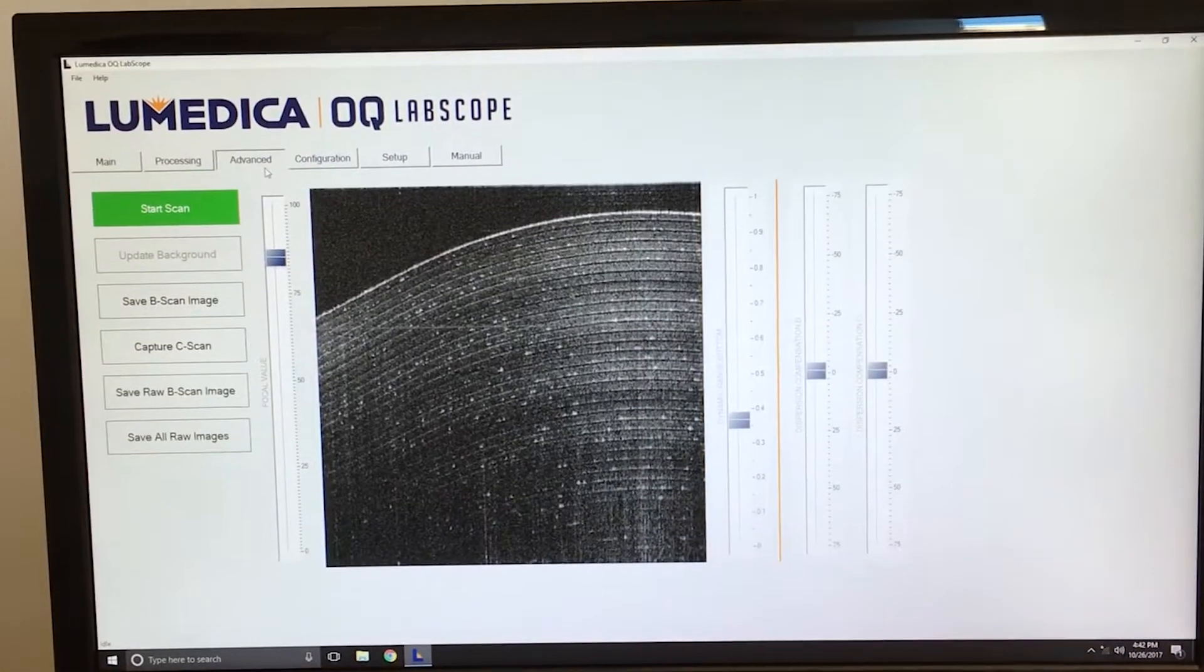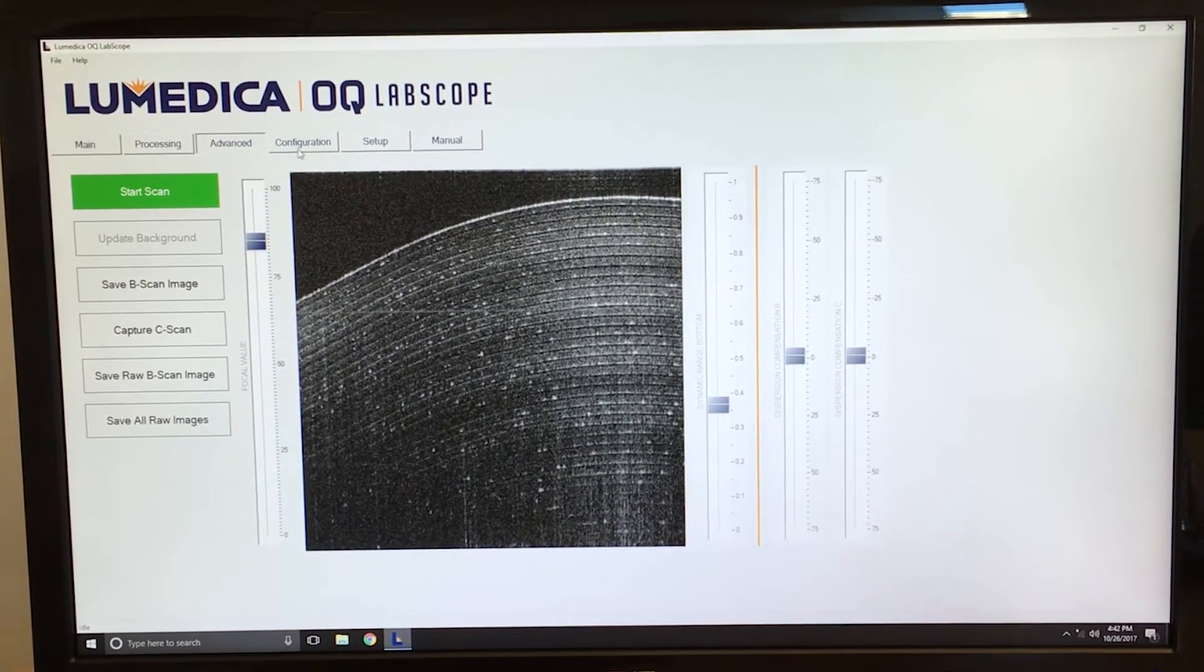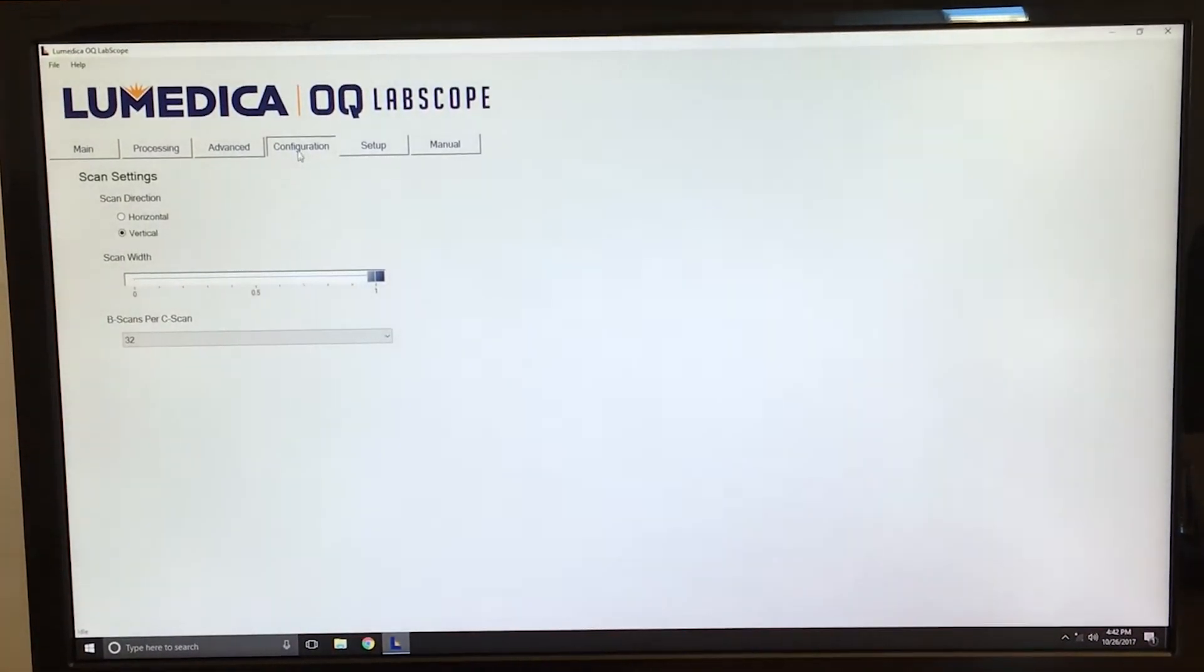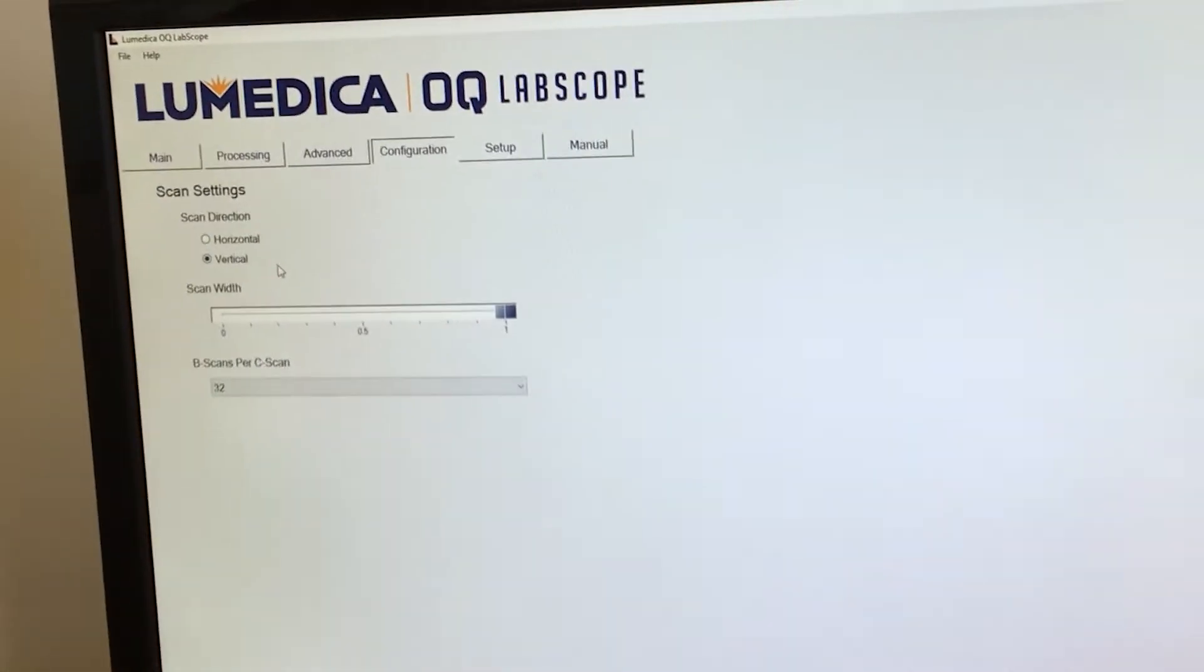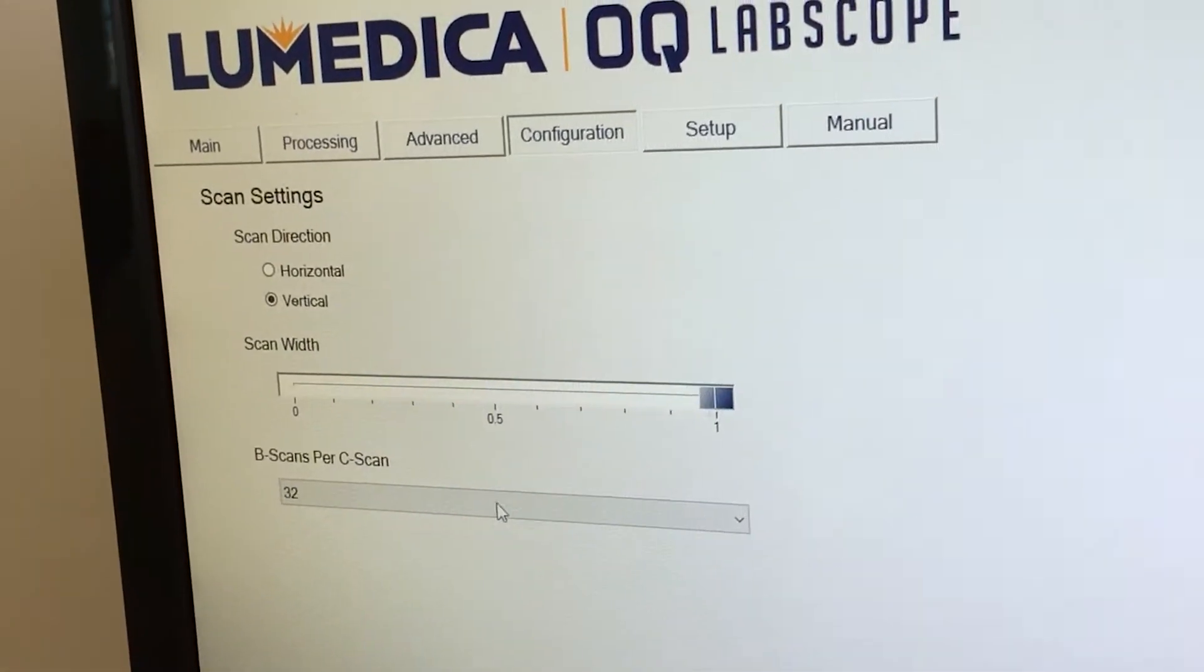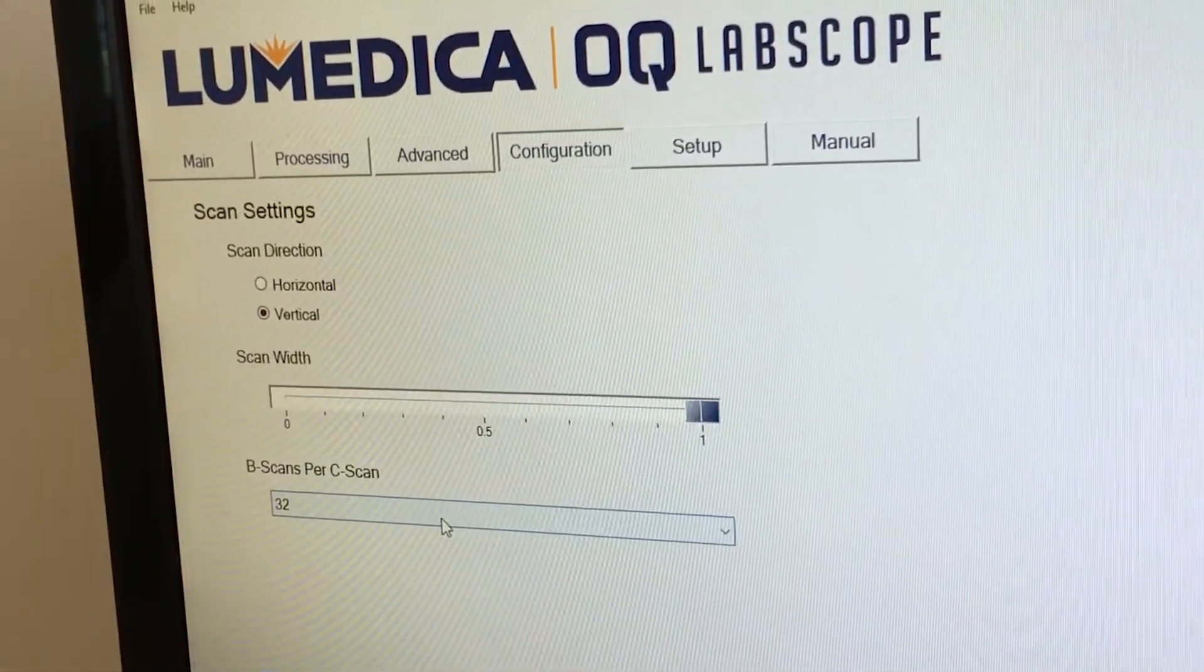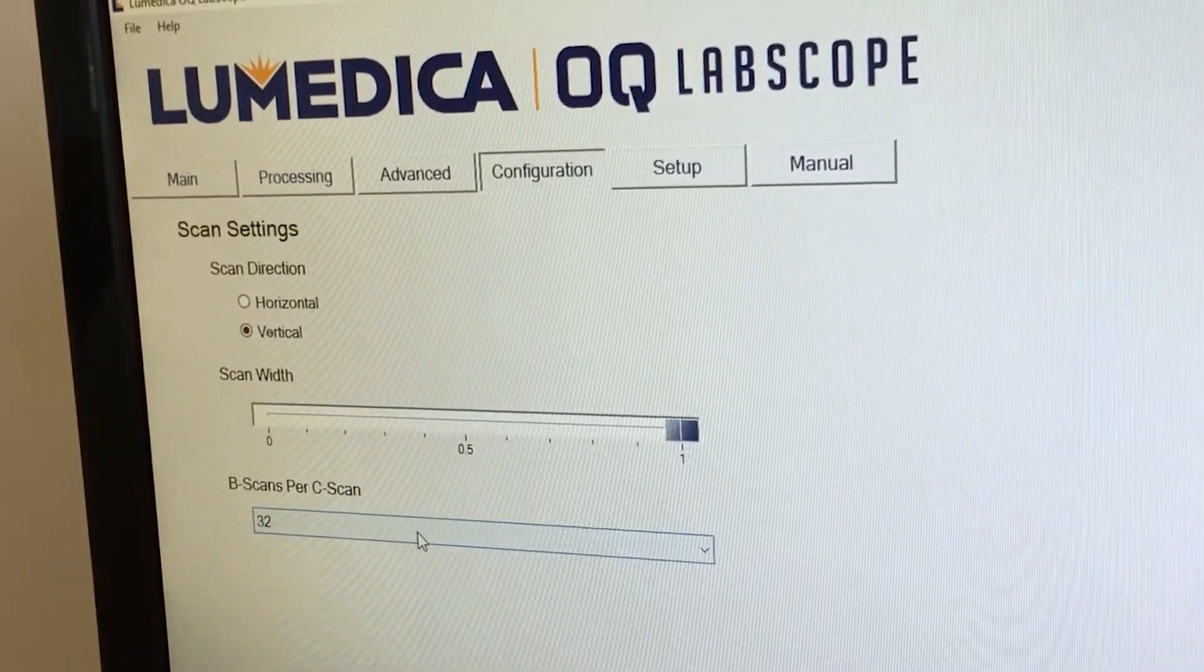Changing scan parameters with the Labscope software is very easy. Simply click on the Configuration tab, and you can change the scan direction from horizontal to vertical, you can change the scan width, or control the number of B-scans that you include in each volumetric C-scan.